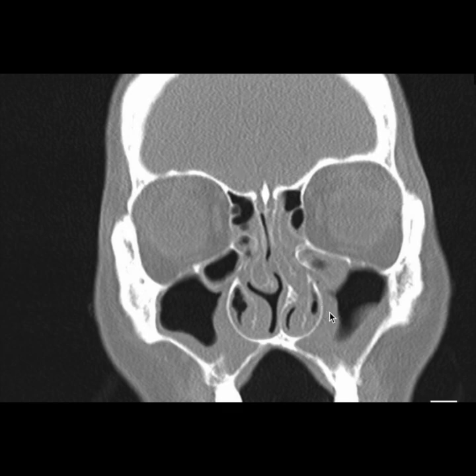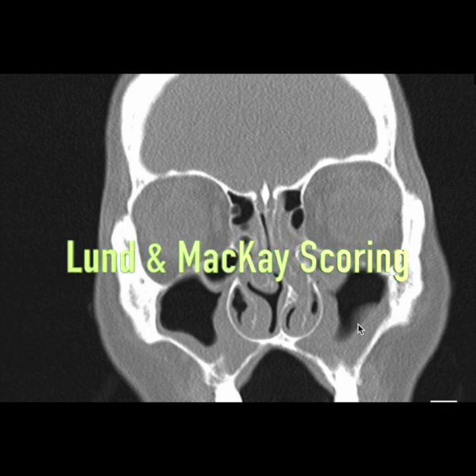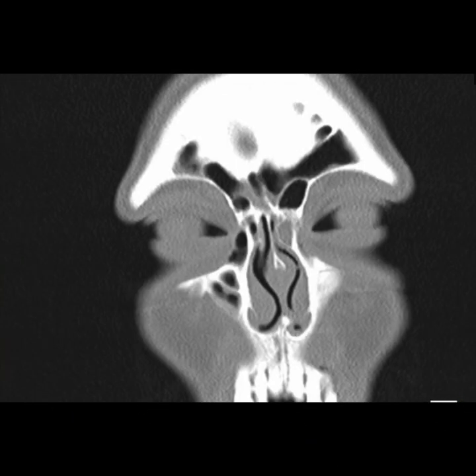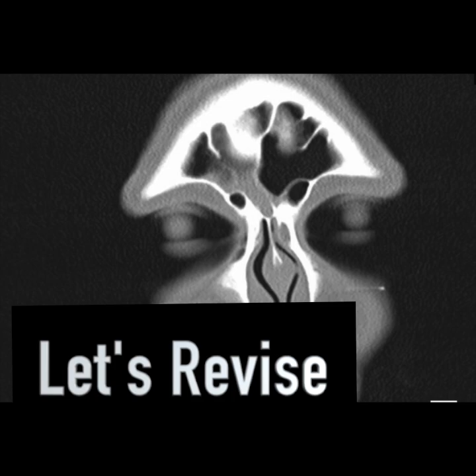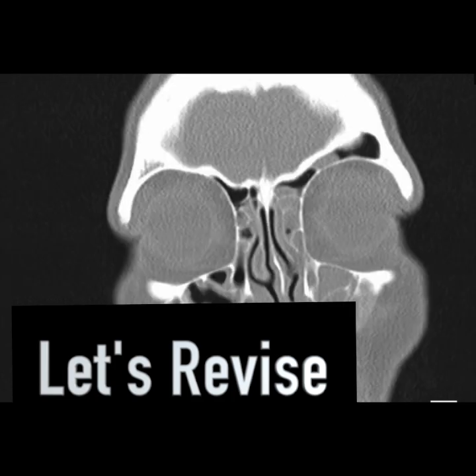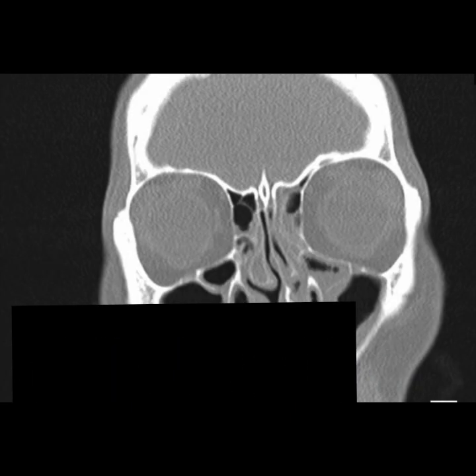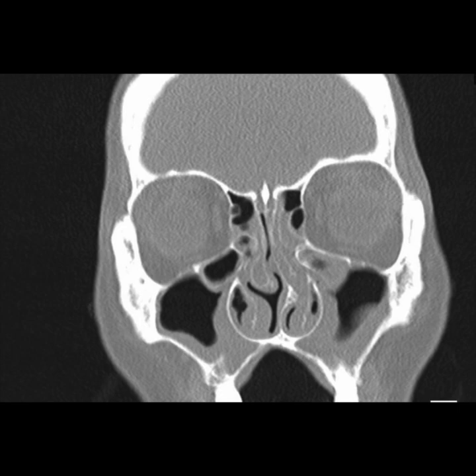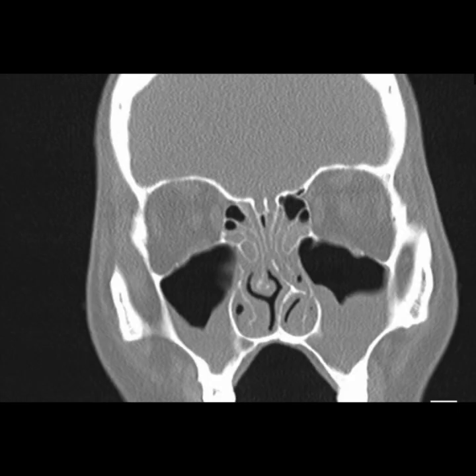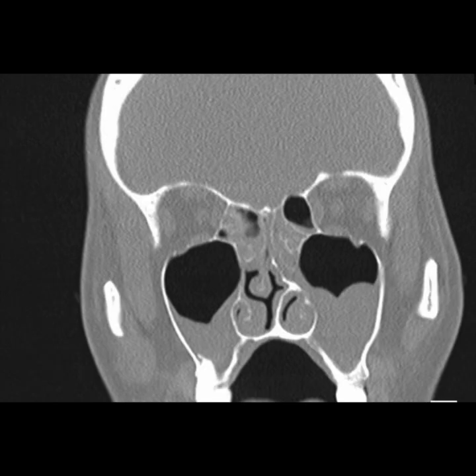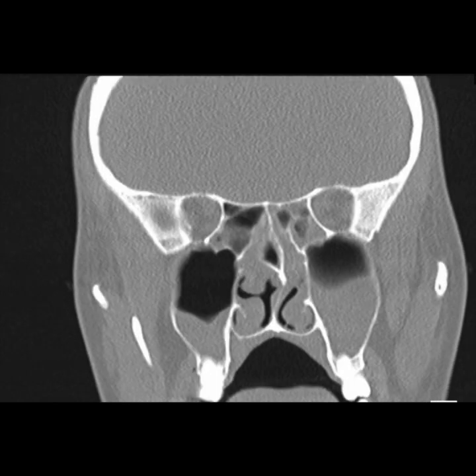The radiological features can be scored using the Lund-Mackay scoring system. It depends on how the sinuses are opacified and also accounts for the ostiomeatal complex involvement. Having a quick look at the scan again: going from the frontal sinus posteriorly, we have seen the agger nasi and frontal cells, then the Haller cell, then the deviated septum and concha, going all the way back into the posterior ethmoids and now the sphenoid.